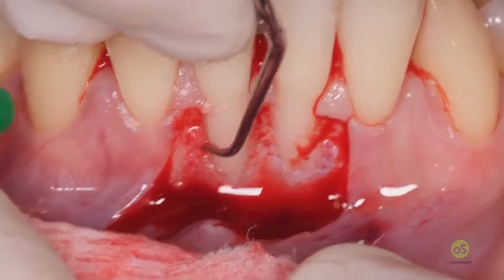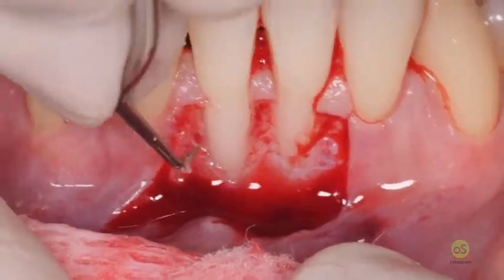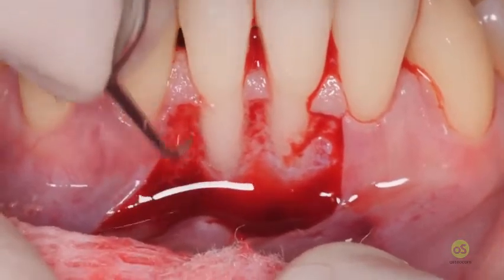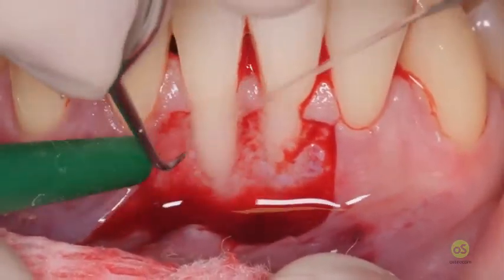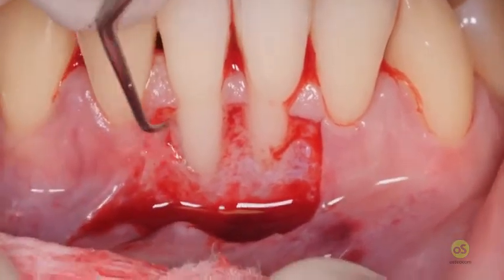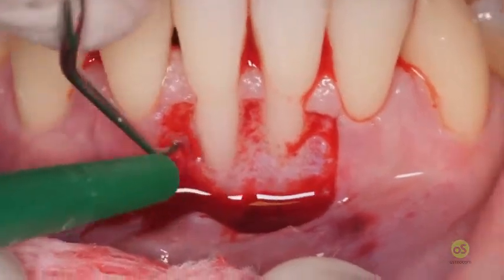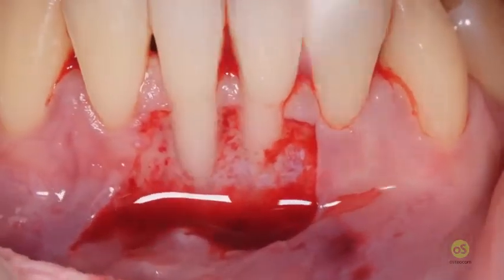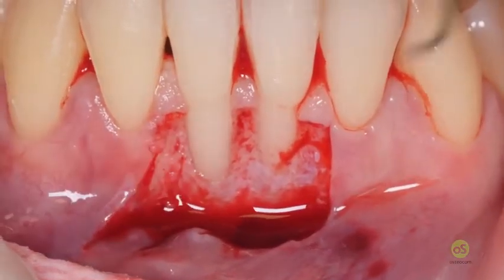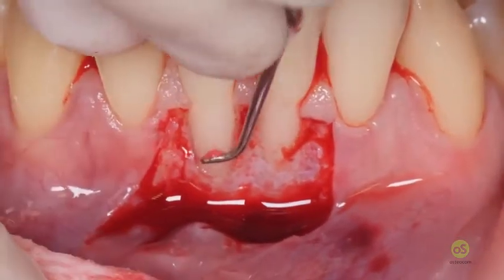This is the area with the small amount of bone loss. So I want to remove the whole connective tissue, so as to have also some bone regeneration in the infrabony component of the defect, where the graft is working as a barrier to prevent the soft tissue from collapsing in this area.